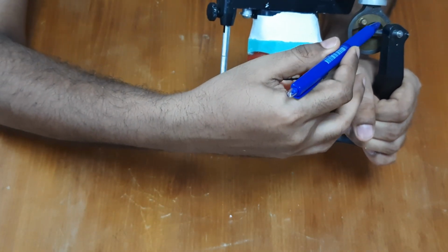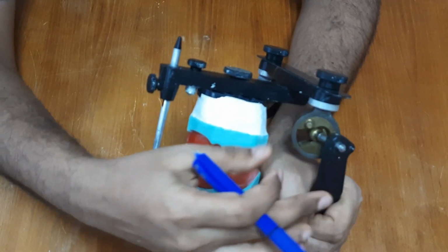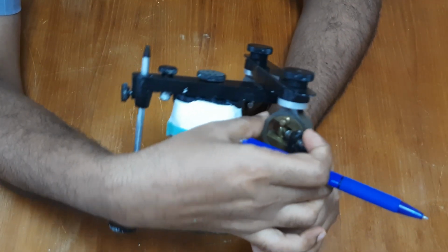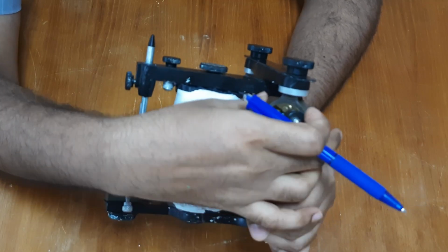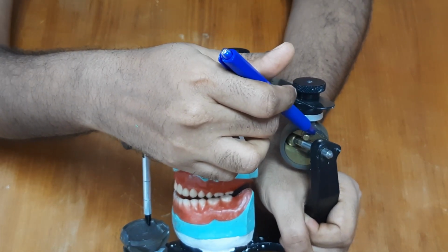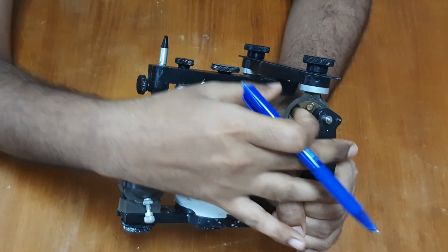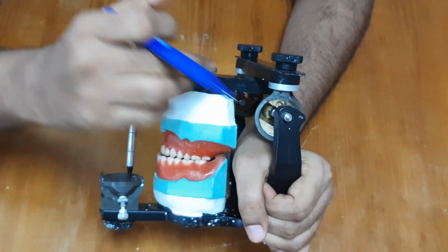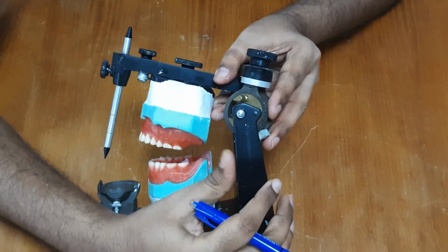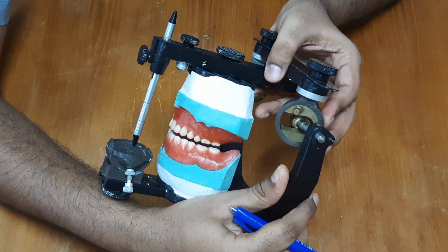The posterior end of the condylar track has what is called a centric stop. It stops the condylar element when the condylar element hits against it. So right at the back, that is the condylar stop. The condylar element, once it reaches the condylar stop, cannot move any further back.